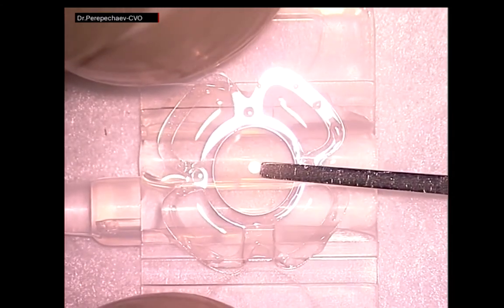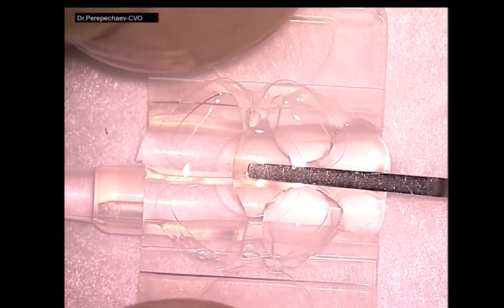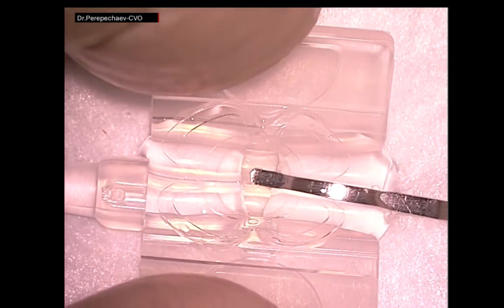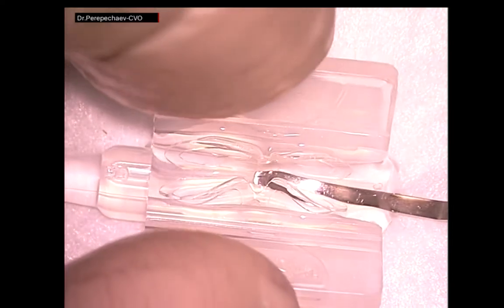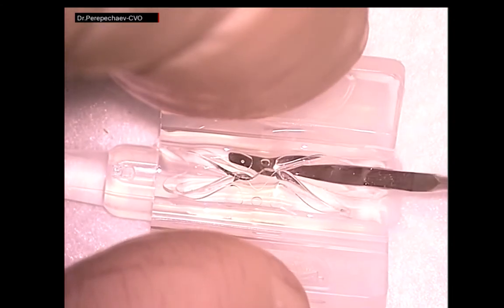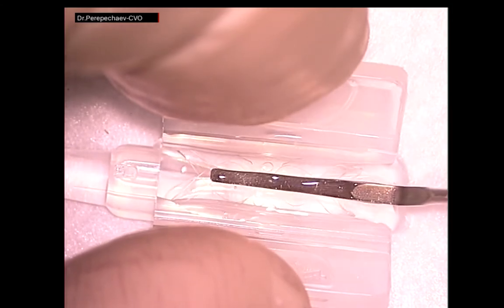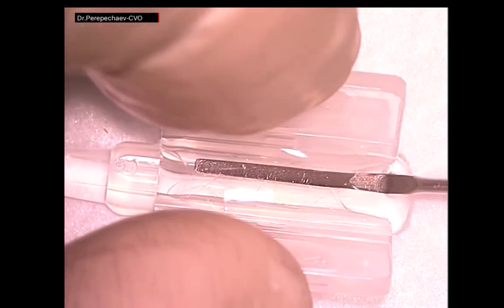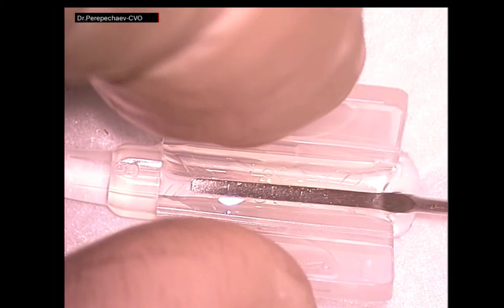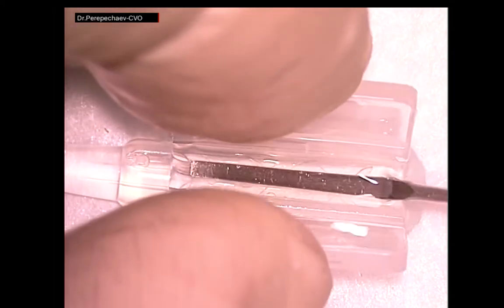We take a microsurgical spatula, press on the center of the lens, pressing the lens tightly to the bottom of the cartridge, and slowly bring together the wings of the cartridge while continuing to press the lens with the spatula. As we fold the lens, we fold the haptic elements of the lens on top of each other, as if folding the lens into a tube. All movements should be gentle and careful.